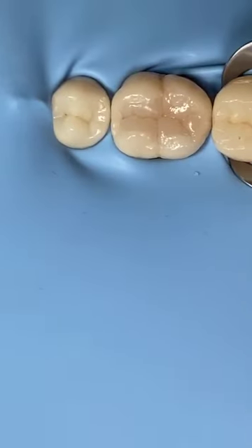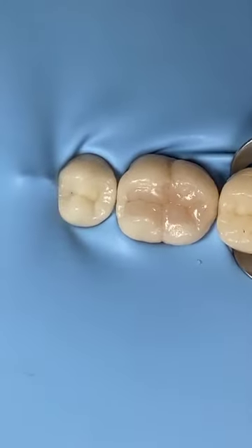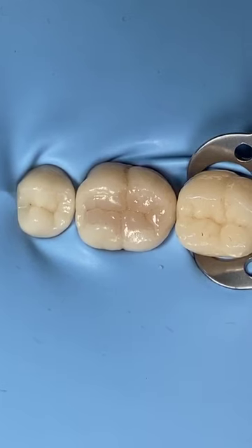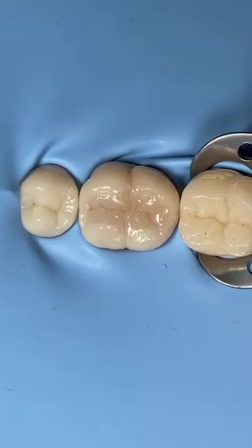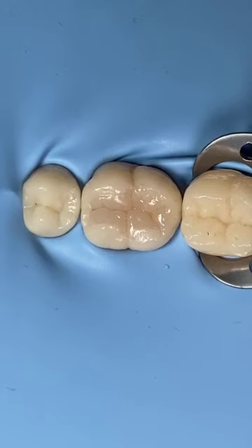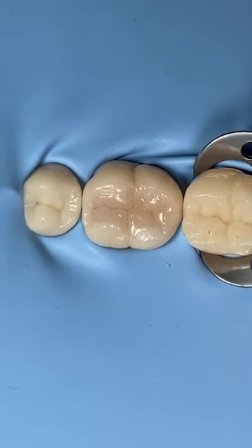Before you do staining, I would love to do polishing first. I don't know, because in my logic, if you have a rough surface, let's say because it's not polished yet, the surface is a bit rough, something like that. If you place the stain, the stain will retain on that rough surface. So for me, I would love to do polishing first.